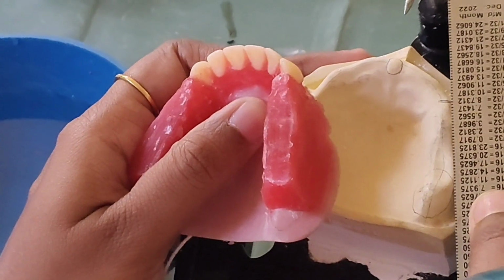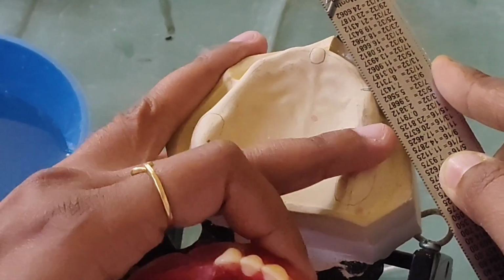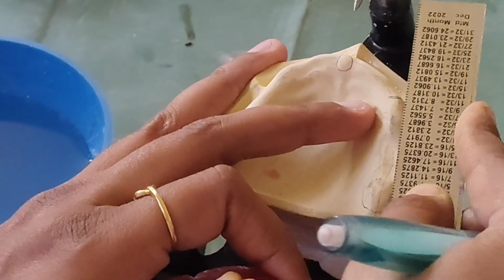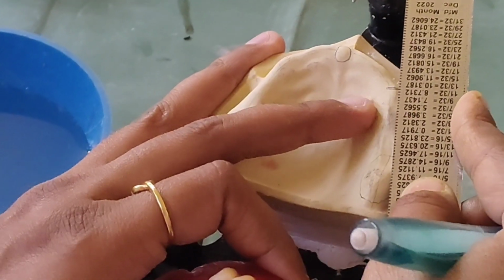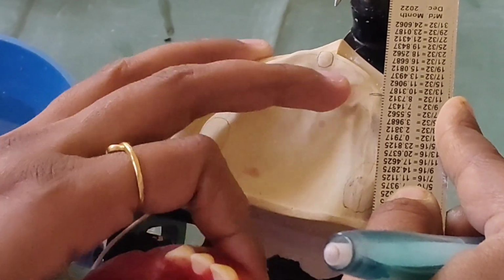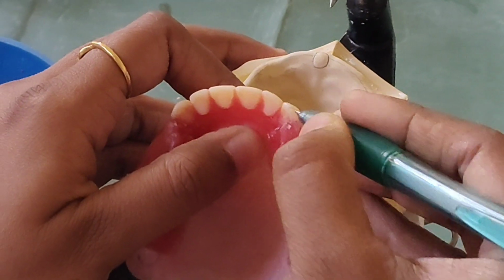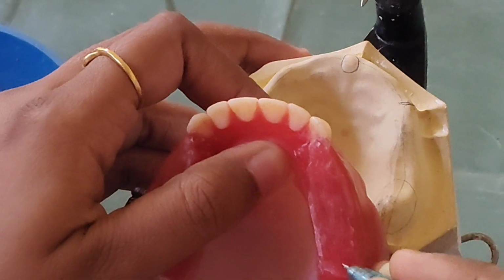In the same line it will come. Towards the ridge. We cannot keep it like this, and we are saying in the same line it is coming. Towards the ridge, like this we have to keep, and here only all the posterior teeth will come. This shows this coming along with this part.